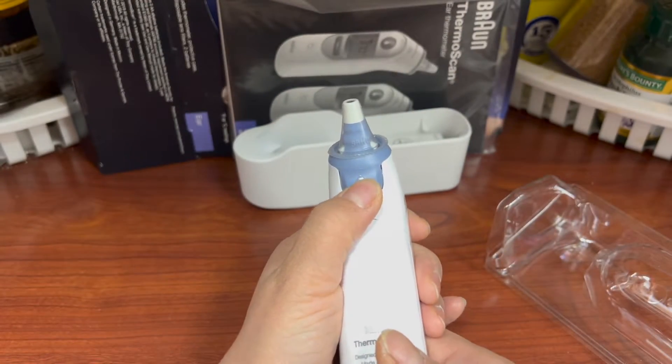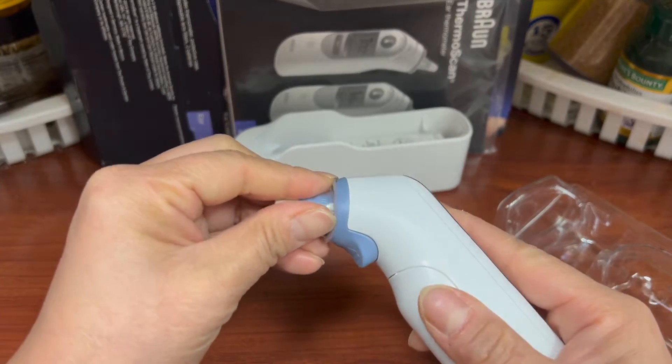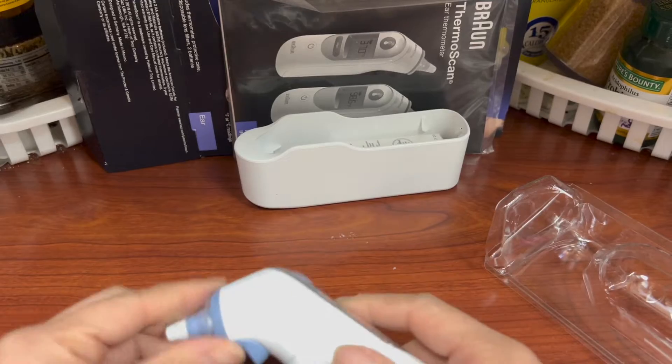So this button — press — you can get rid of the probe. Isn't that cool?